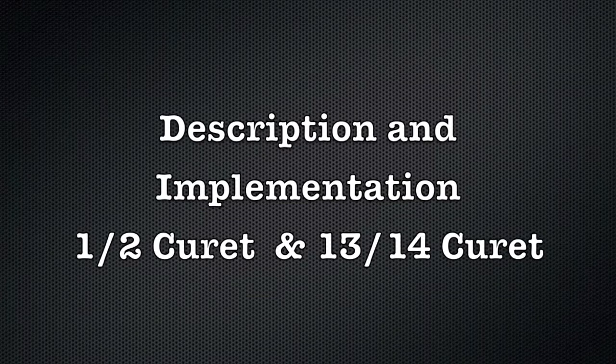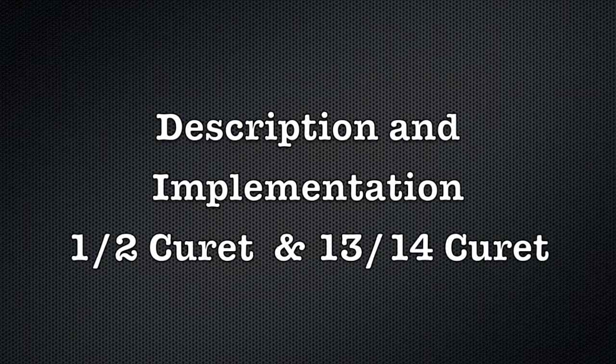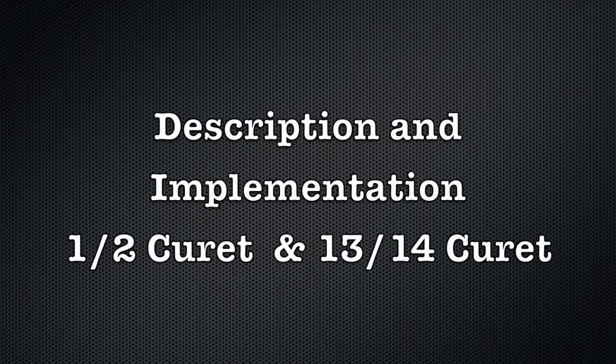This is an informational video to give you a brief description and show you the correct implementation of the 1-2 curet and the 13-14 curet.